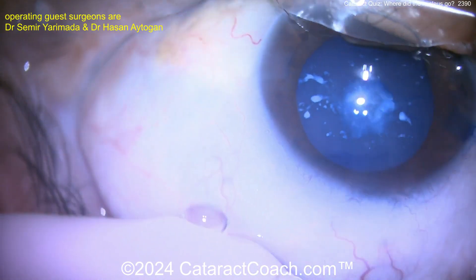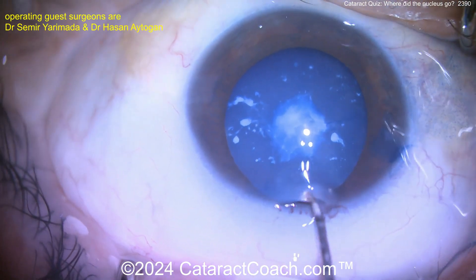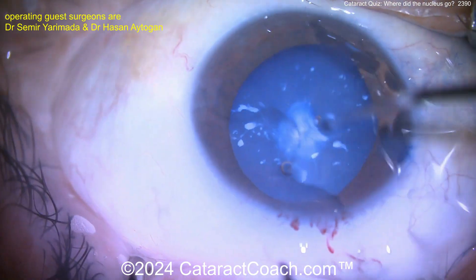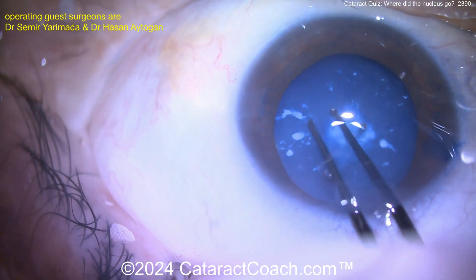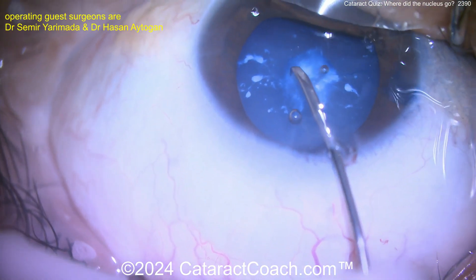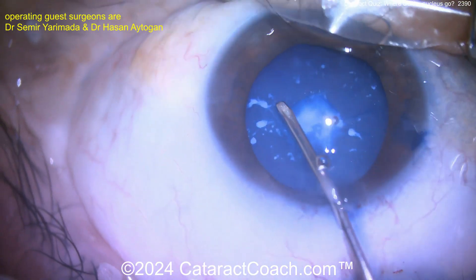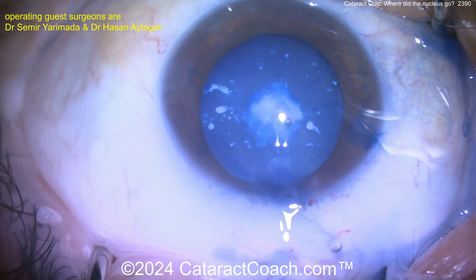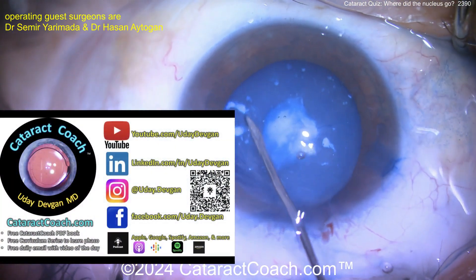Let's watch the capsulorhexis in progress. Poking in with a cystotome — look how resistant it is. Maybe trying to grab with scissors. There are forceps going in now, then the cystotome again. It's really hard to poke in. Look at the laxity of the anterior lens capsule — wow, unusual, right?